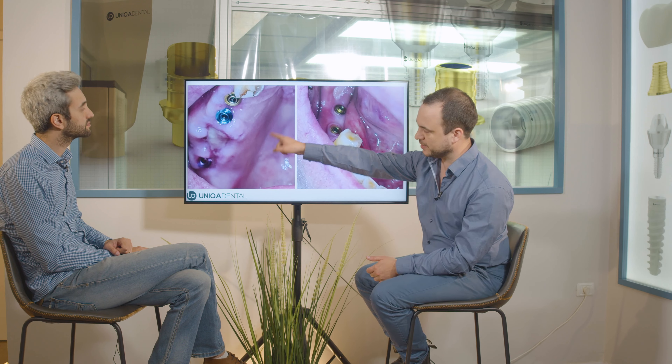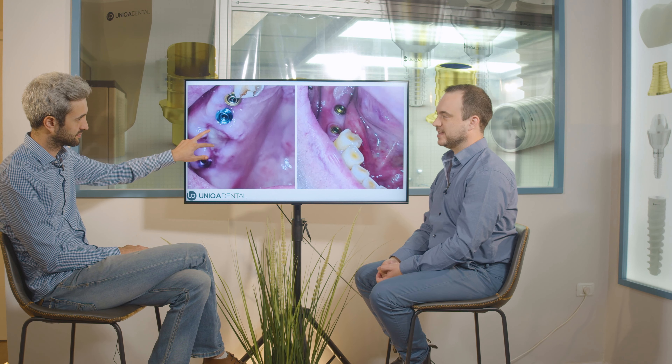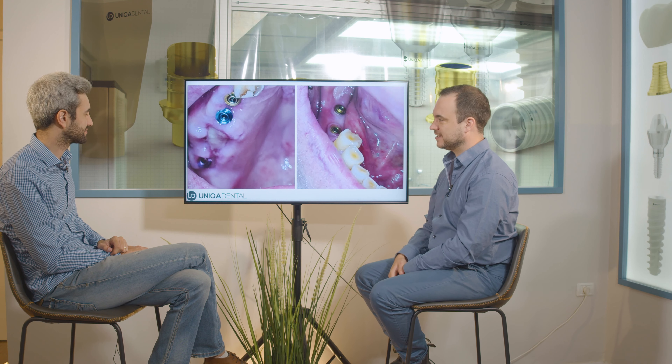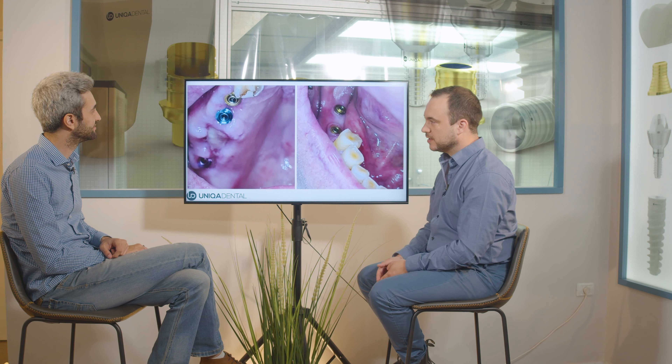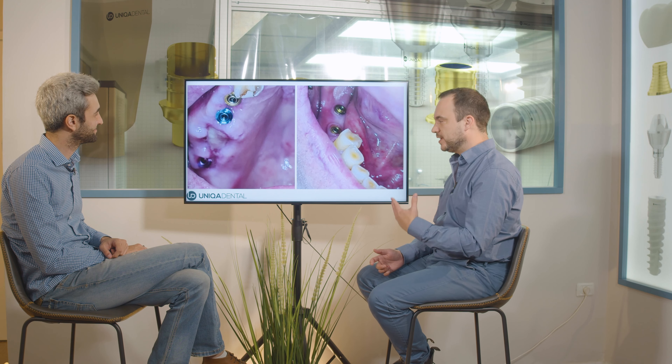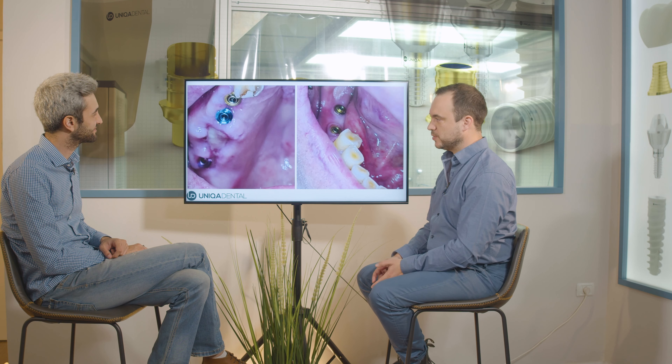Later on the patient needed to extract a tooth. What you can see that still hasn't healed — it's not the root, it's the fibrous tissue that closes on the socket of the tooth after extraction.